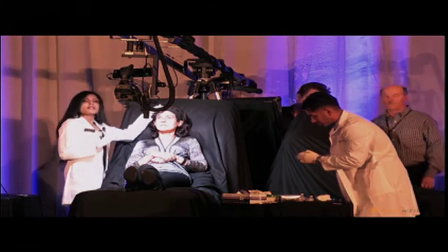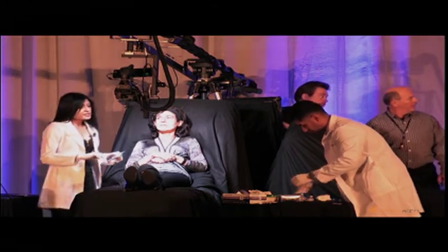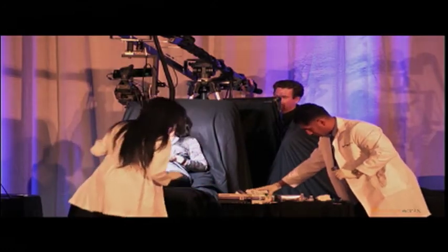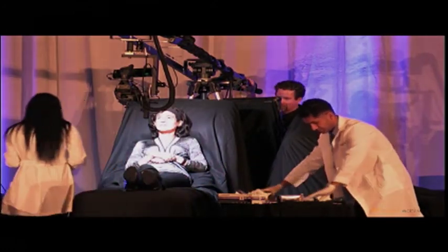So when we look at Katya's face, Matthew, can you pass me the pointer if it's there? Never mind if we don't see it. When we look at Katya's face, what we can see is that she has quite significant mid-face volume loss. And for me, it all really begins with volumizing the mid-face. So I'm going to start with some Radiesse.